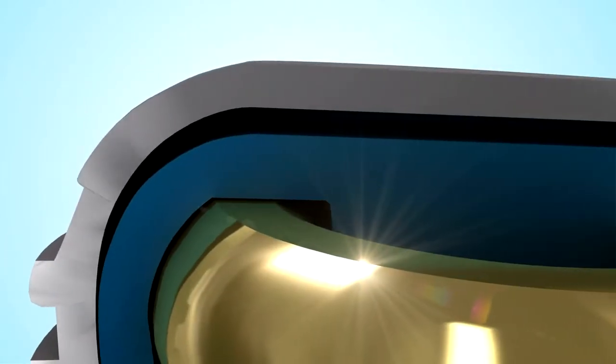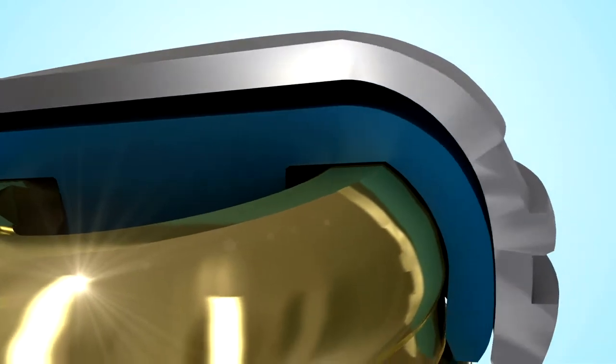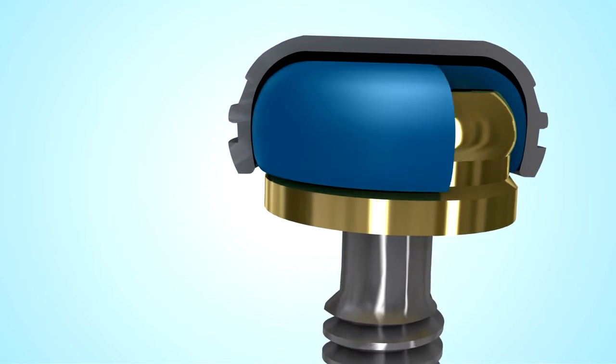For over 40 years, Zest Anchors has been a global leader in the design and manufacturing of over-denture attachments, pioneering self-aligning attachments that make it virtually impossible to improperly seat an over-denture.